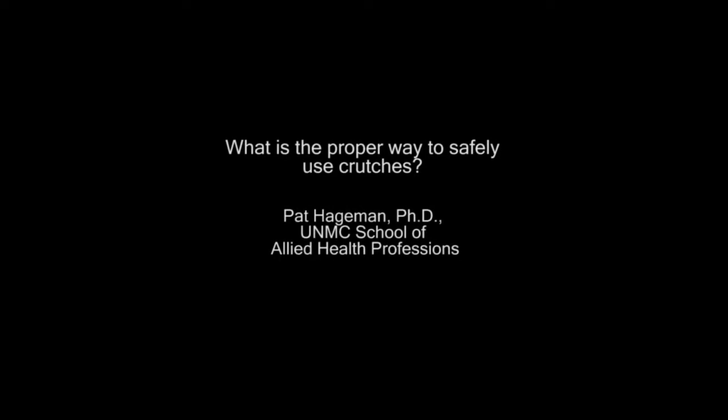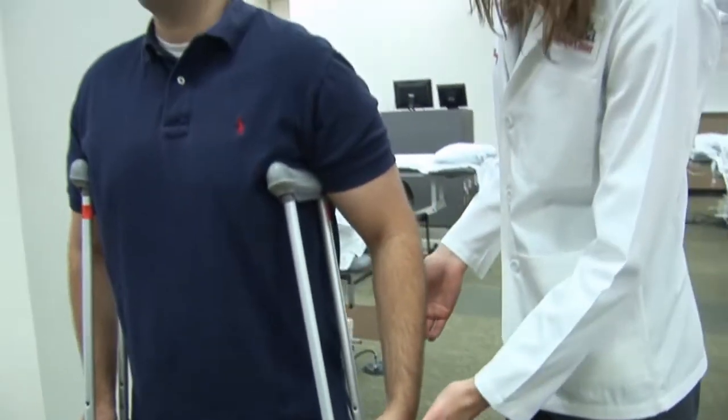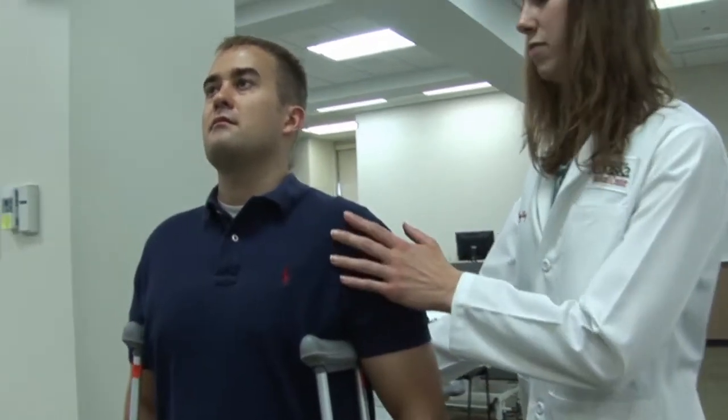What is the proper way to use crutches? Crutches should be fitted so that the armrest is about two fingers below your underarm when you're standing up straight, and your wrist should be at the level of or slightly below the hand bar when your arms are resting at your side, so that your elbow is slightly bent when you have your hands on the hand bar.